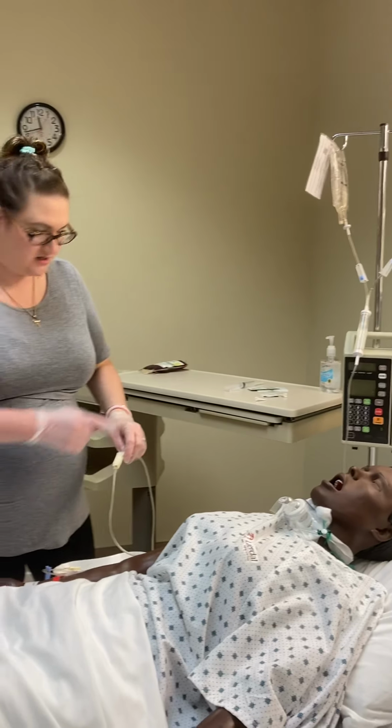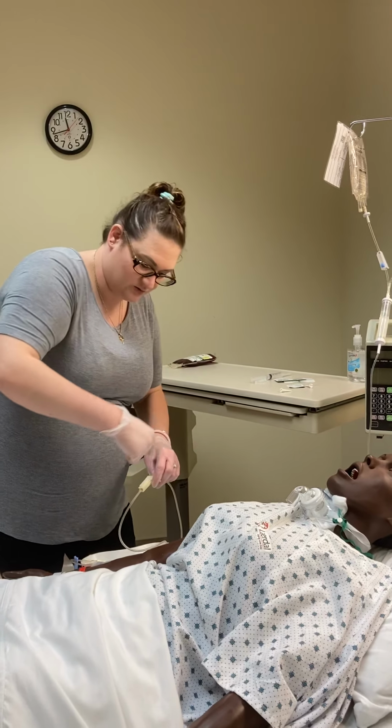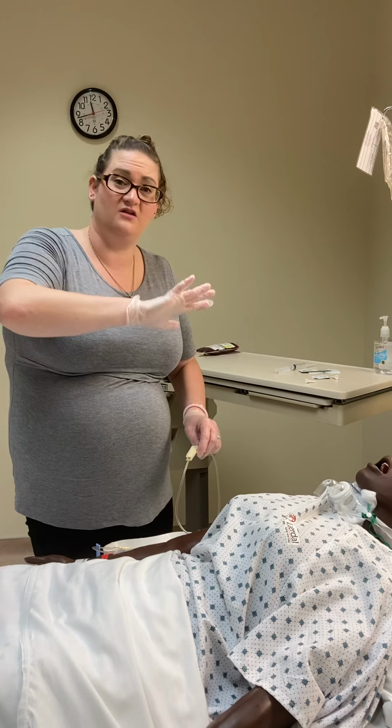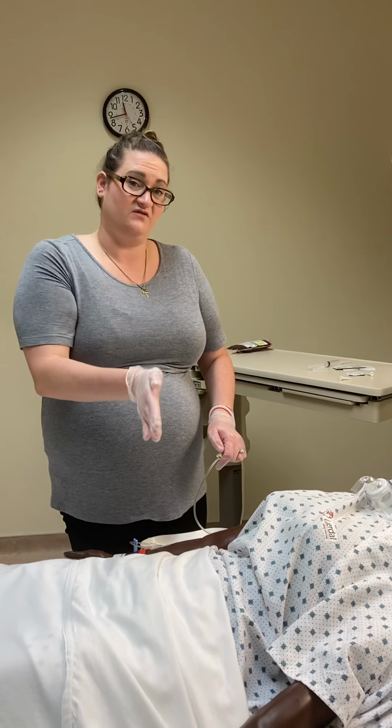And I see that the blood has traveled all the way down the tubing and is going into the patient. I start my timing, and in 5 minutes, I'm going to take a set of vital signs. Obviously watch for any alterations in breathing pattern, or if they complain of pain. Then I'll do another set at 15 minutes, at 30, at 1 hour, and then every hour, or whatever your facility's policy is. Bear in mind, if there's any change in condition with your patient, you're going to get a fresh set of vitals right then and there.